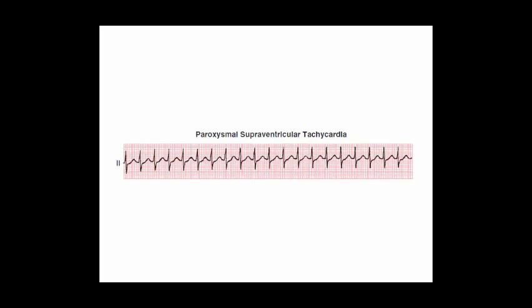This is maybe the most typical pattern of supraventricular tachycardia ECG that's visible on ECGs done during tachycardia, either on the monitor screen or during Holter monitoring of these patients. This is the classic pattern of supraventricular tachycardia, and this is the most usual ECG we'll see before admitting the patient to the EP lab.